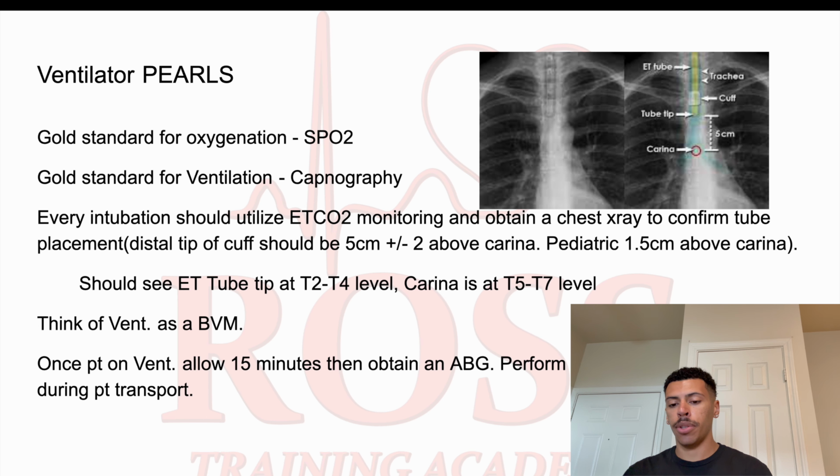And then remember to think of the ventilator almost as a BVM. So if you are going to use a BVM on a person, you can use a ventilator on the person. If the ventilator is not working for that person, you can use the BVM to breathe for that person.